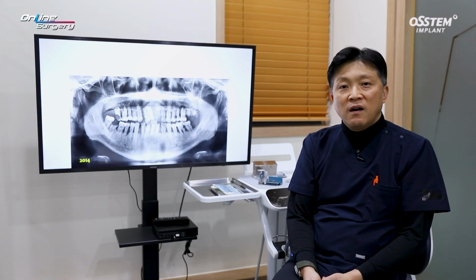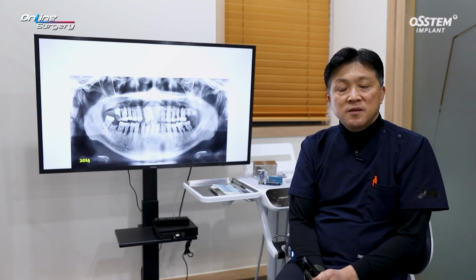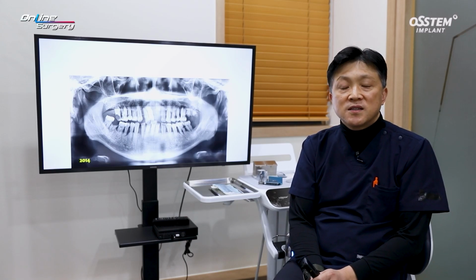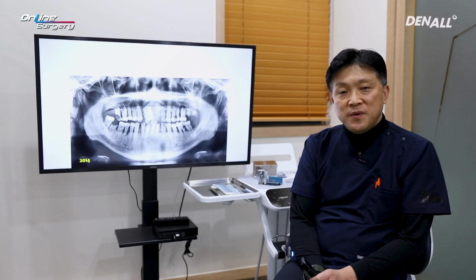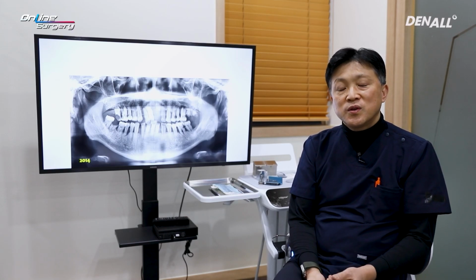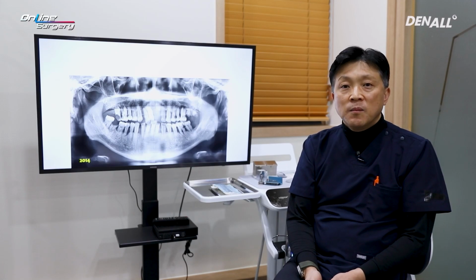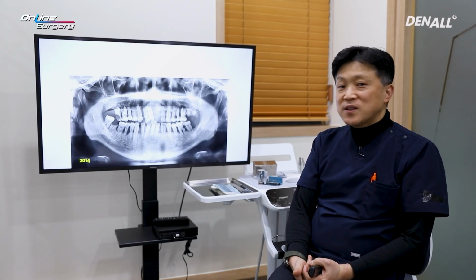This is the surgical case of the day. After removal of a failed implant, because it was not viable to place an implant immediately, bone graft was done in the same way as ARP. Let me show you the patient first.